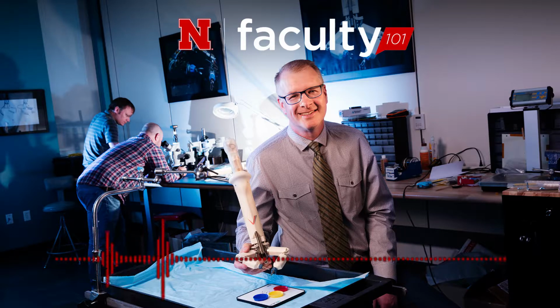The robotically assisted surgical device is being used in a procedure that removes part of the colon. There's about, depending on how you count them, maybe 300,000 cases of colon cancer per year in the U.S. And when you have cancer or other diseases, you have to get a section of your colon removed, and we think we can help enable a minimally invasive approach to colon resection. The technology will help avoid large incisions and long hospital stays for patients and offers other benefits for surgeons.